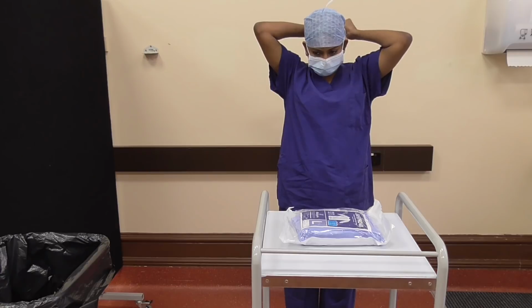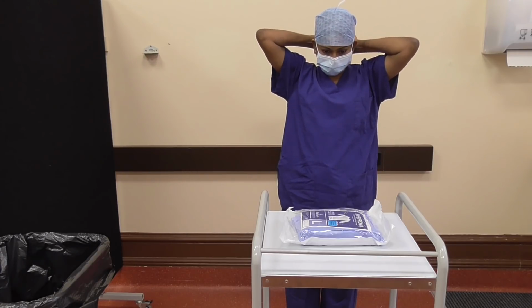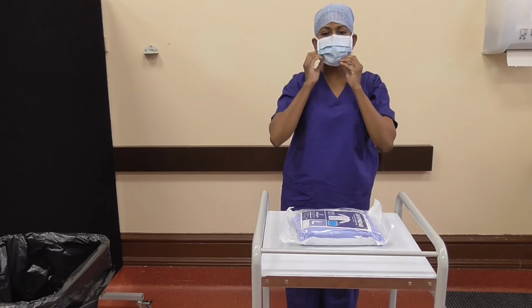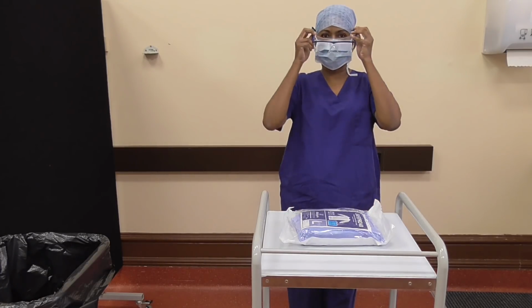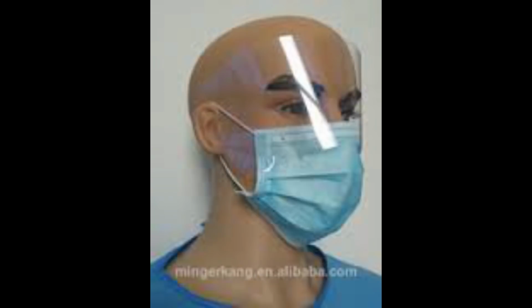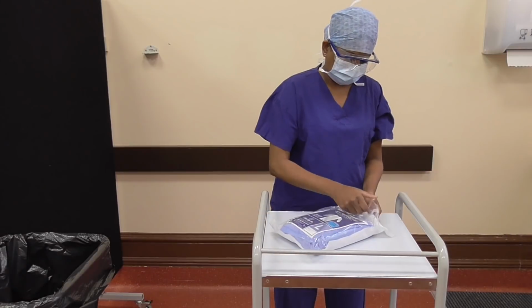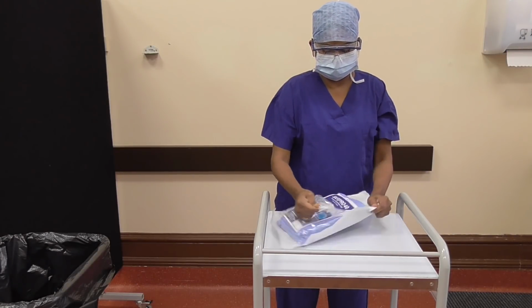I'll pinch the nose so that it doesn't move up. Put on the goggles, or you could use a mask with a shield attached as it's shown in this image. I will need a sterile and intact packet of gown.